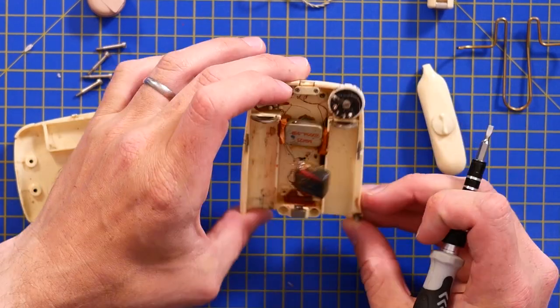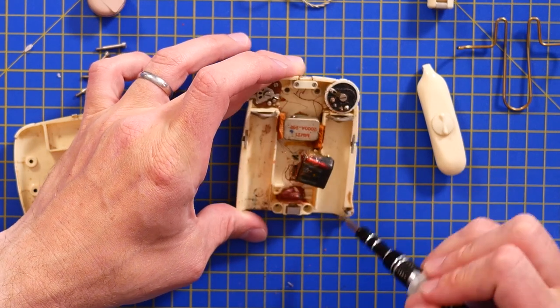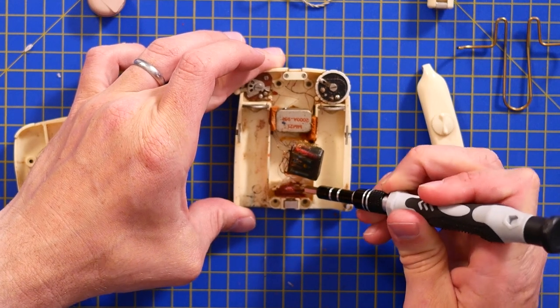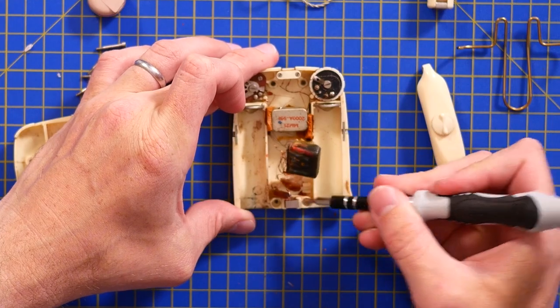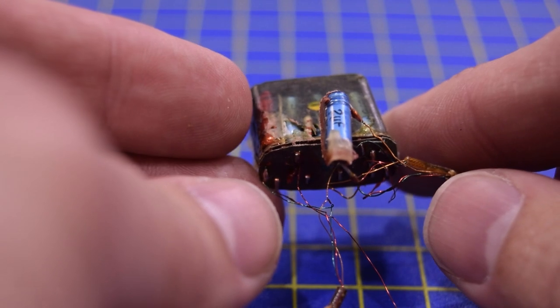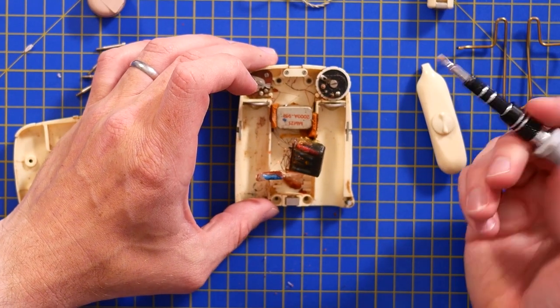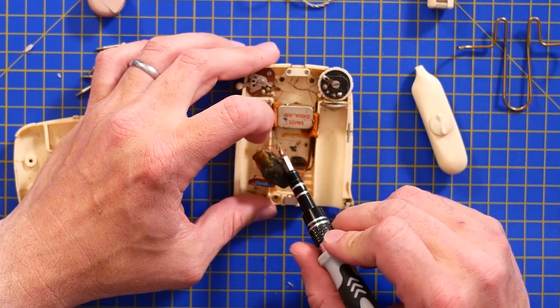What are these terminals for at the bottom? Power definitely comes from the two battery contacts at the top, so what are these for? They look like they're under sealing wax or something. There's a little capacitor — a 2 microfarad capacitor. I guess they didn't want to embed that in the epoxy because of the electrolyte and the possibility of leaking, so it's obviously a component prone to failure.